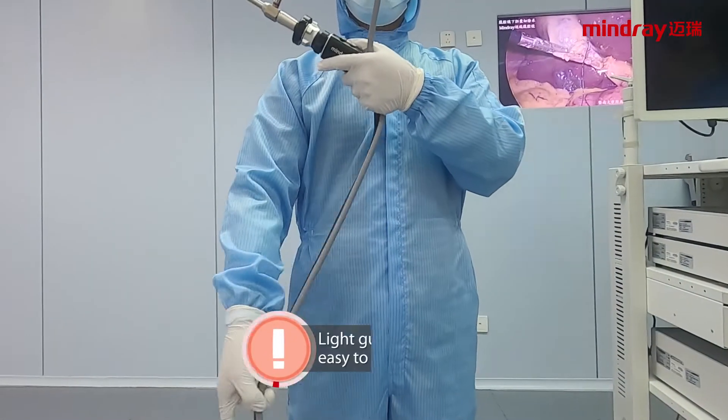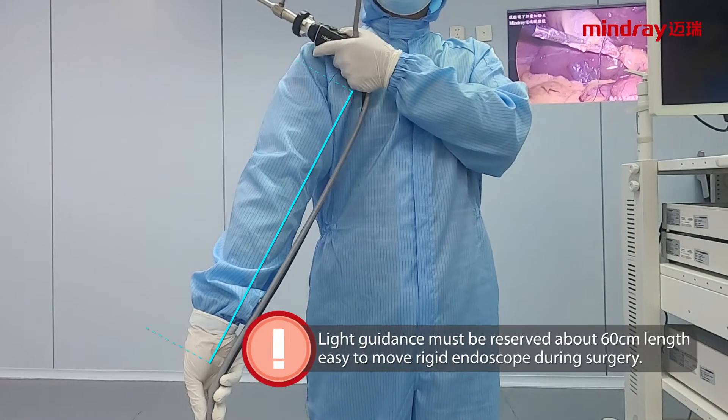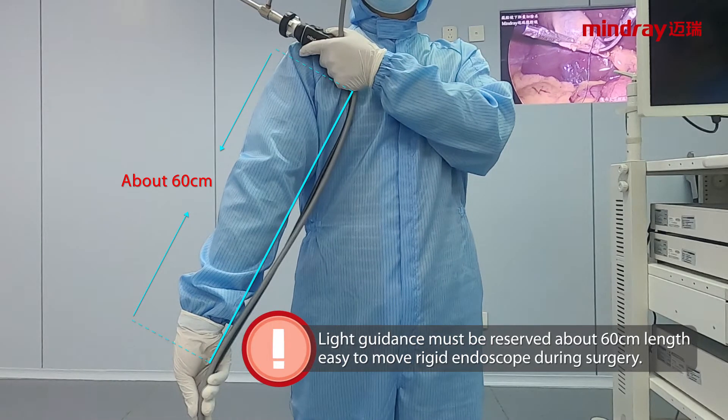Attention: the light guidance must have a reserved length of about 60 cm to allow easy movement of the rigid endoscope during surgery.